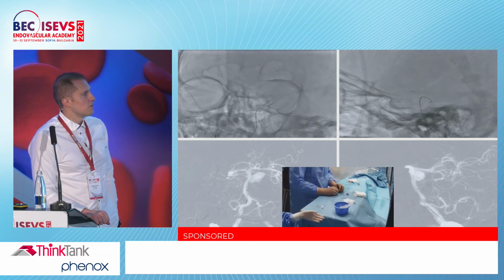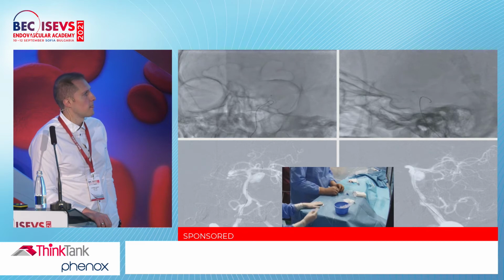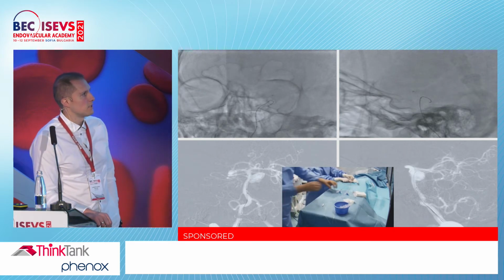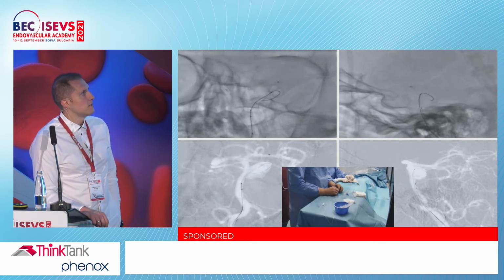So we start the procedure. This is the navigation. We go for the left PCA because the anatomic variation was easier to navigate. The next step is delivering the stent inside the microcatheter. If I remember correctly, it was a Phenom 21, the catheter we used. I didn't mention the P48 stents come through a 021 catheter. So this is the delivery of the stent.